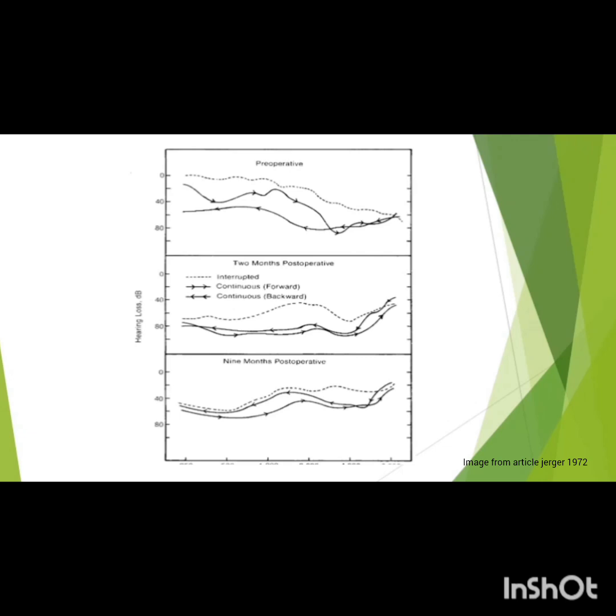As you can see, the preoperative Bekesy pattern is of type 4, and in the preoperative Bekesy pattern you can see a greater discrepancy in backward and forward Bekesy, and the last two indicate the postoperative Bekesy, where you can see the discrepancy becomes smaller in the postoperative course.